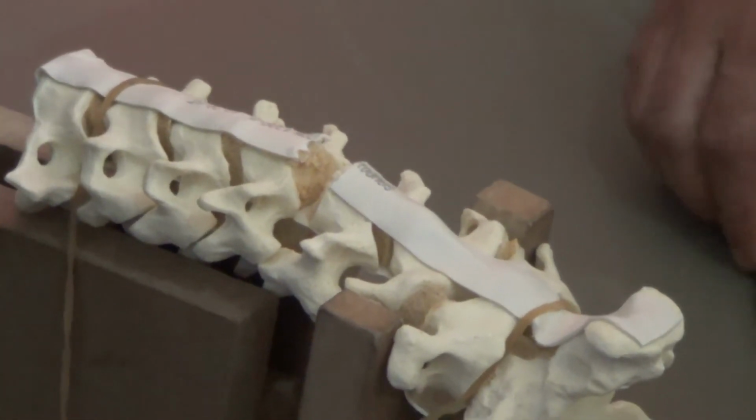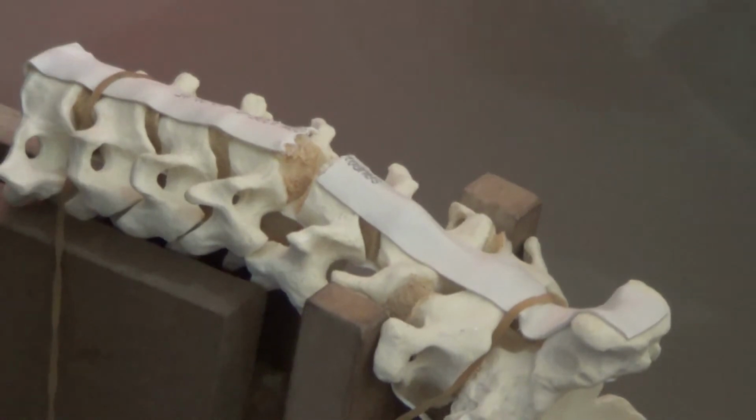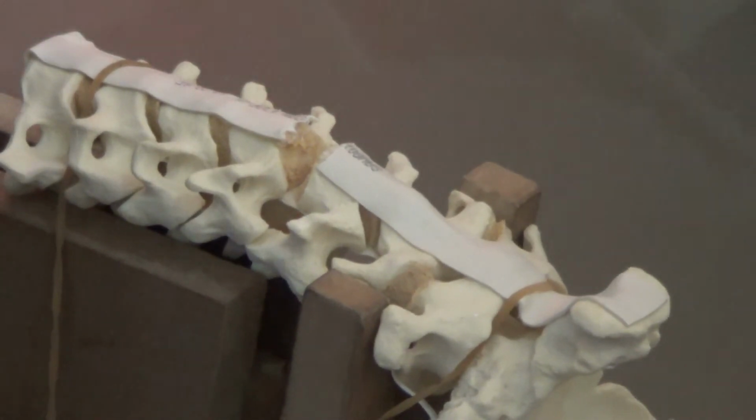I use a 15 blade. Somebody likes to use the 11 blade, but 11 is very pointed. Yeah, discectomy knife. I use a 15 blade.